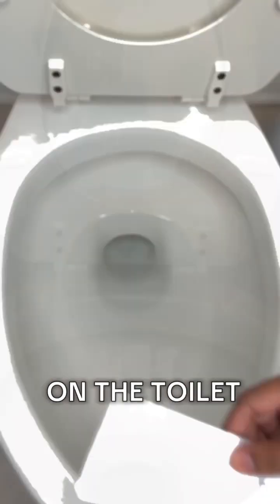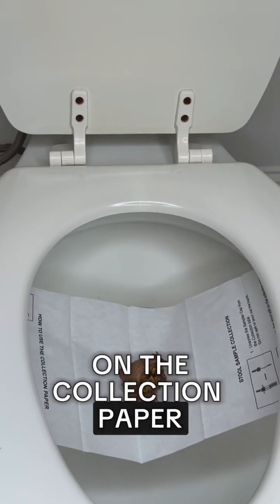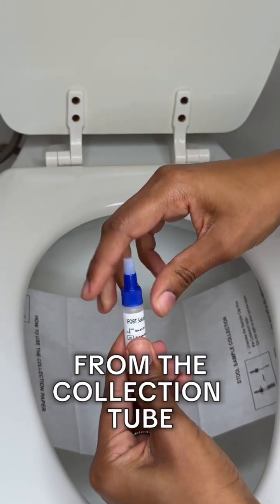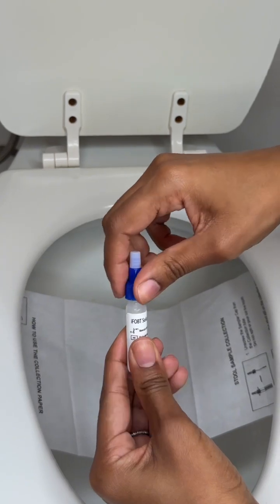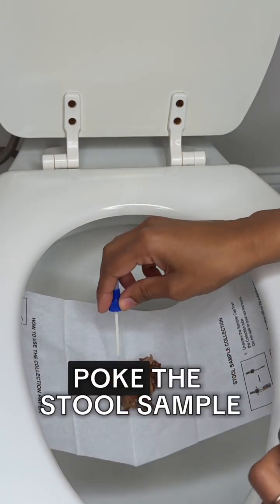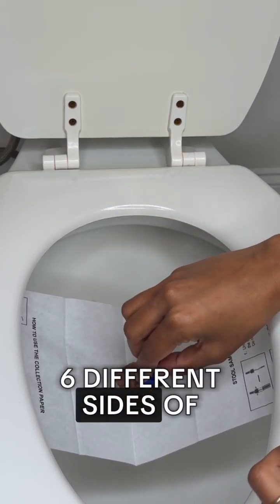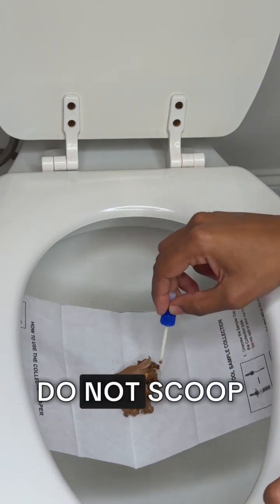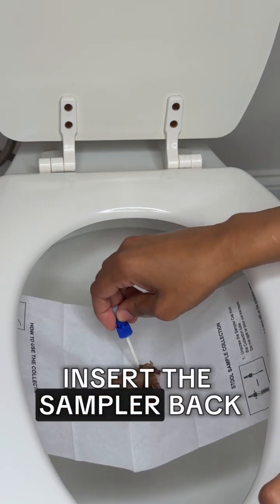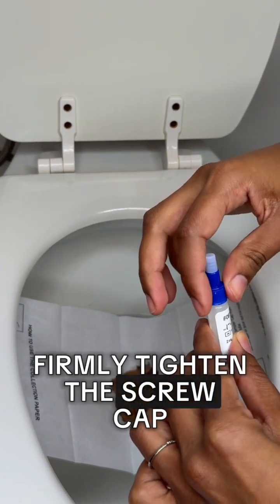Secure the collection paper on the toilet and have a bowel movement on the collection paper. Unscrew the sampler cap from the collection tube — do not spill or pour out the liquid. Randomly poke the stool sample with the sampler stick in at least six different sites of the stool. Do not scoop. Insert the sampler back in the collection tube.